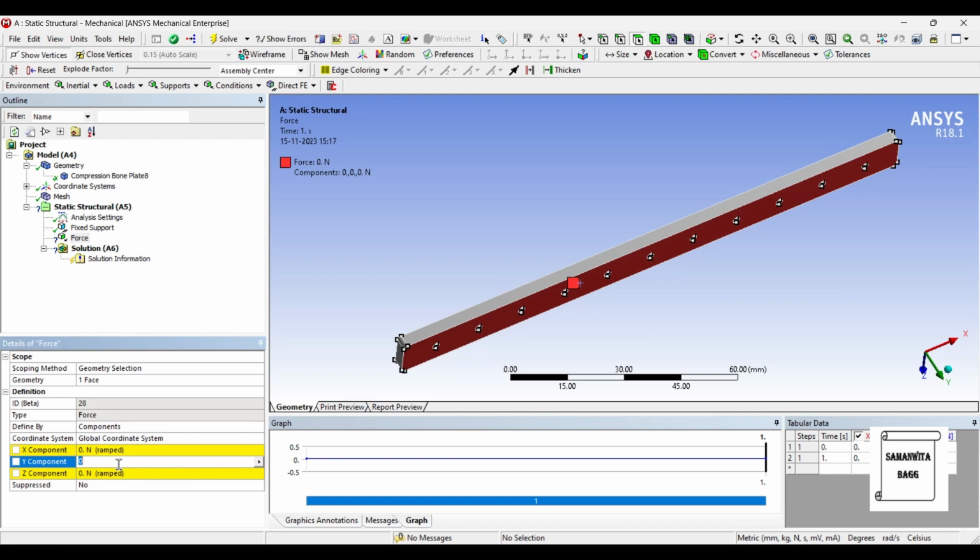Now for calculation of load, there is a particular technique that is used. Suppose I assume that the mass of the patient who is going to use this plate on his bone is say 70 kgs. So it is roughly 10% of the weight of the patient. So the weight will now be 70 into 10, which will make it 700 newton, and 10% will be 70 newton. So I'm going to apply 70 newton on this body. So this is how you apply the load.